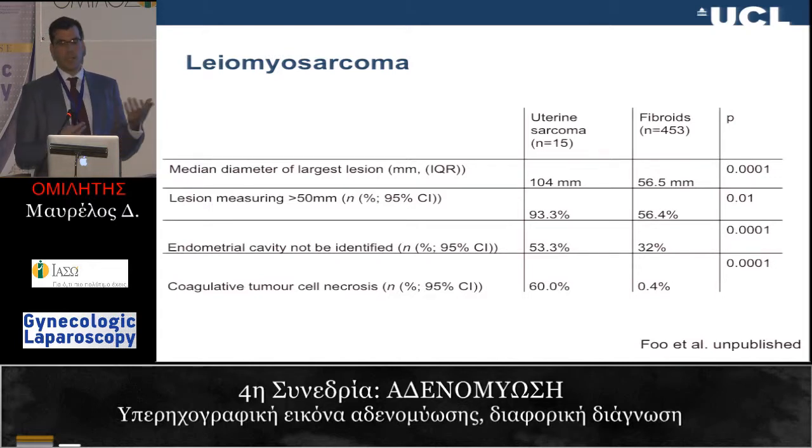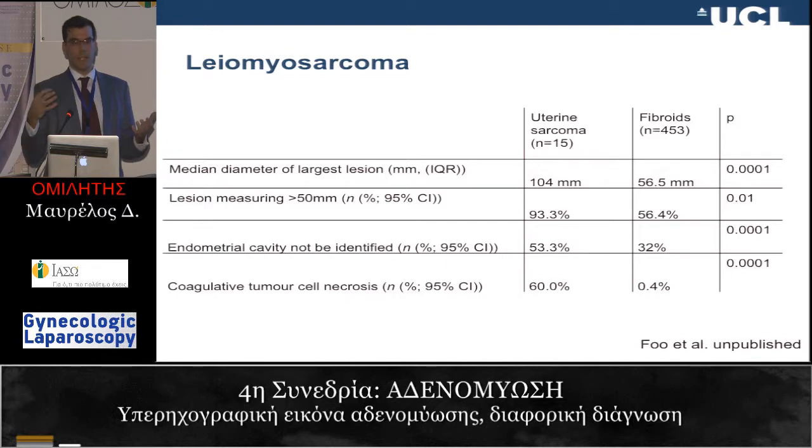By definition, a cancer does not respect tissue boundaries. So that's true in any occasion. If it's in the ovary, if it's in the uterus, wherever it is, it will distort the anatomy. The structure you are seeing is irregular because it's a cancer. And therefore, in women that have leiomyosarcoma, it makes it much more difficult to identify the endometrial cavity because it's been disrupted. And there's this histological sign, and it's useful actually to look at the histological textbook when you do ultrasound to see what the histopathologists say about the pathology you're looking for. This coagulative tumor cell necrosis, which is pathognomonic of leiomyosarcoma, you can actually see that on scan.